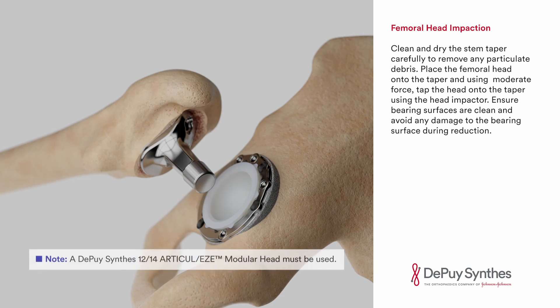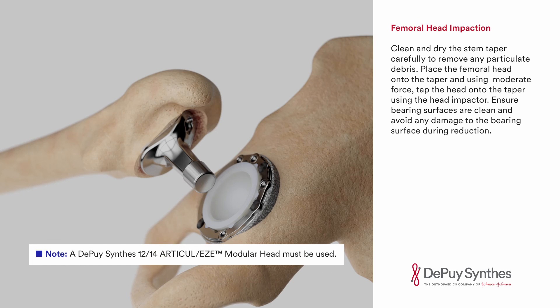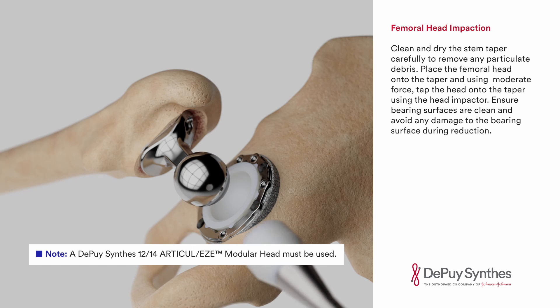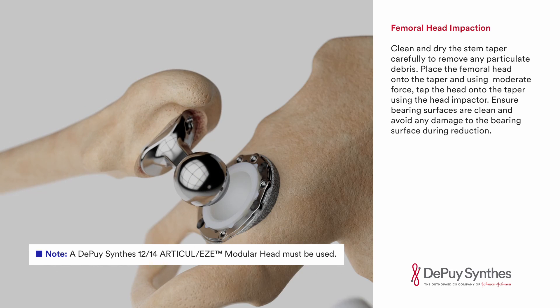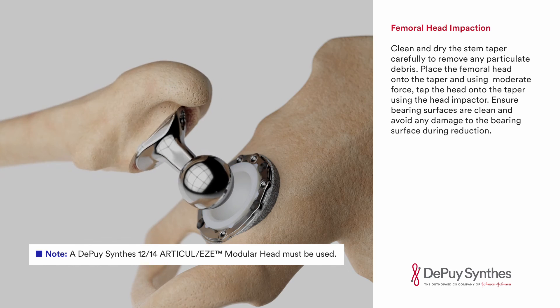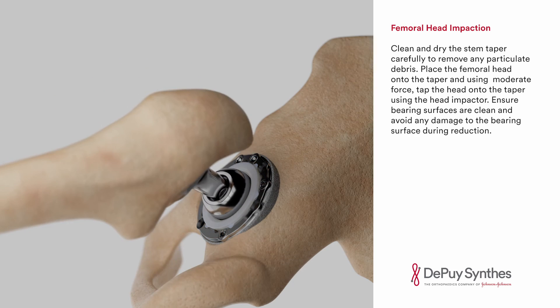Femoral head impaction. Clean and dry the stem taper carefully to remove any particulate debris. Place the femoral head onto the taper and using moderate force tap the head onto the taper using the head impactor. Ensure bearing surfaces are clean and avoid any damage to the bearing surface during reduction.